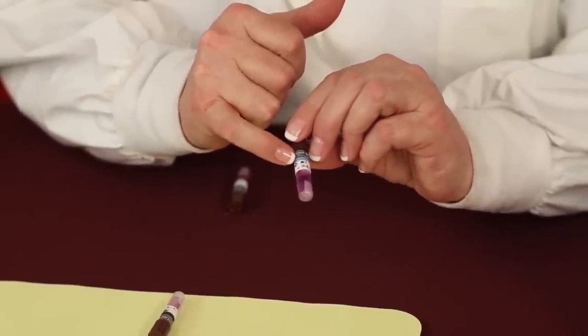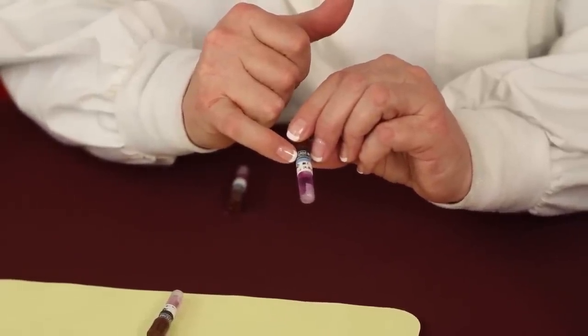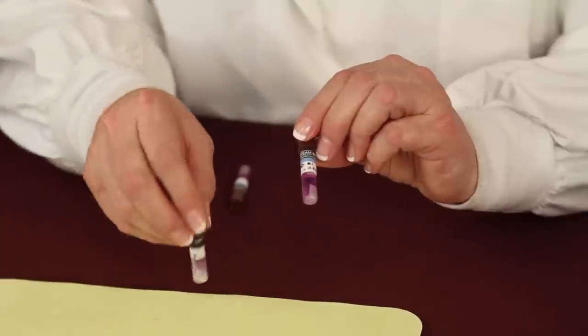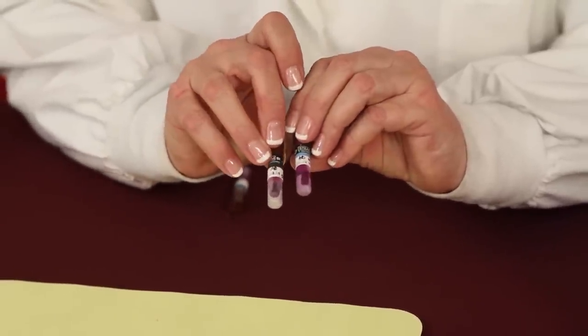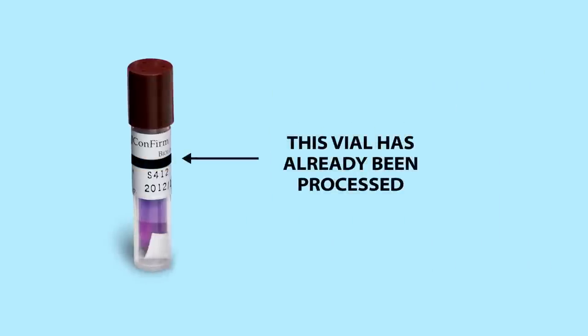When you have the biological monitoring vial, I want you to note that there is a strip, a colored strip on the outside. This is actually a chemical indicator that's used as a process indicator because at the end of the sterilization cycle, that blue line should turn black, which means that this vial has already been processed.